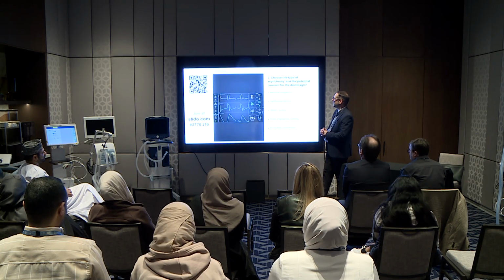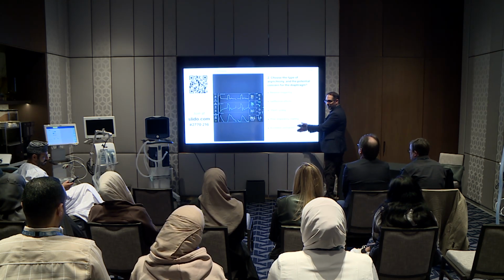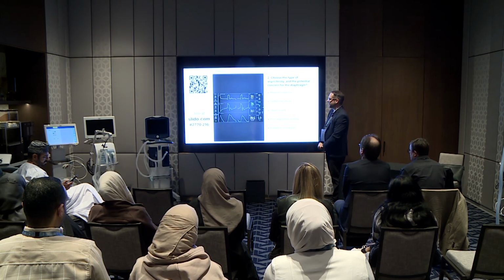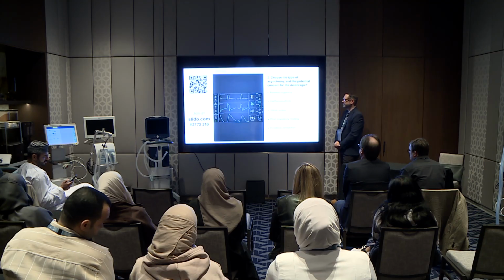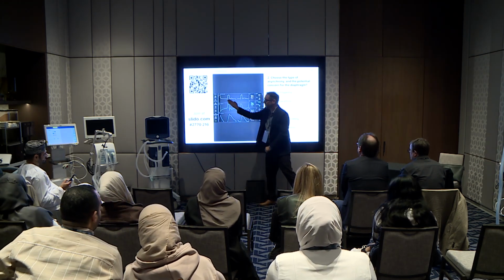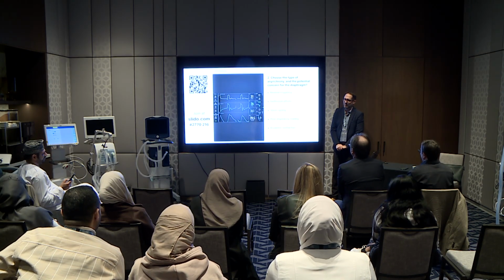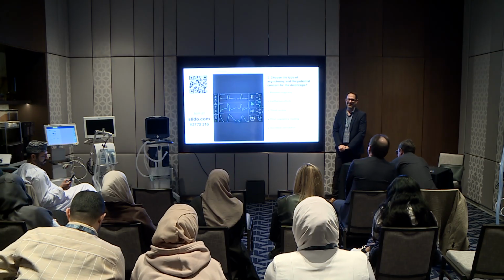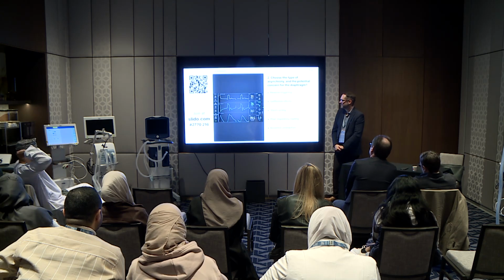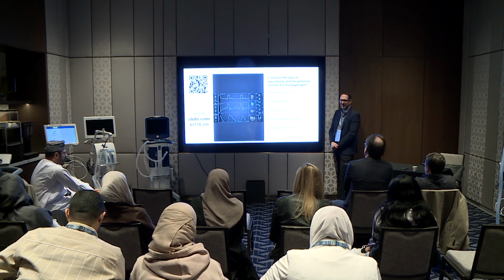Okay, choose the type of asynchrony and the potential concern for the diaphragm again. The concern for the diaphragm is either post-inspiratory or eccentric contraction. And then these are the types of asynchrony that may be represented over there. This one is going to be a very easy process of elimination. The patient is triggering, so clearly it's not reverse triggering. We just had one other one. I'm probably not going to do it twice in a row. So let's see if you can just, looking at the waveforms, figure this out. And then we just discussed how we distinguish eccentric versus post-inspiratory loading.